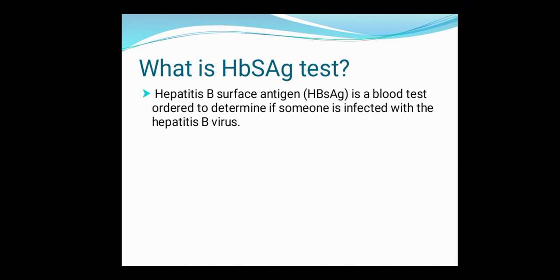During testing, the serum or plasma specimen reacts with the anti-HBsAg antibody conjugated particles, and then the mixture migrates upwards on the membrane chromatographically by capillary action to react with the anti-HBsAg antibodies on the membrane and generate a color line.